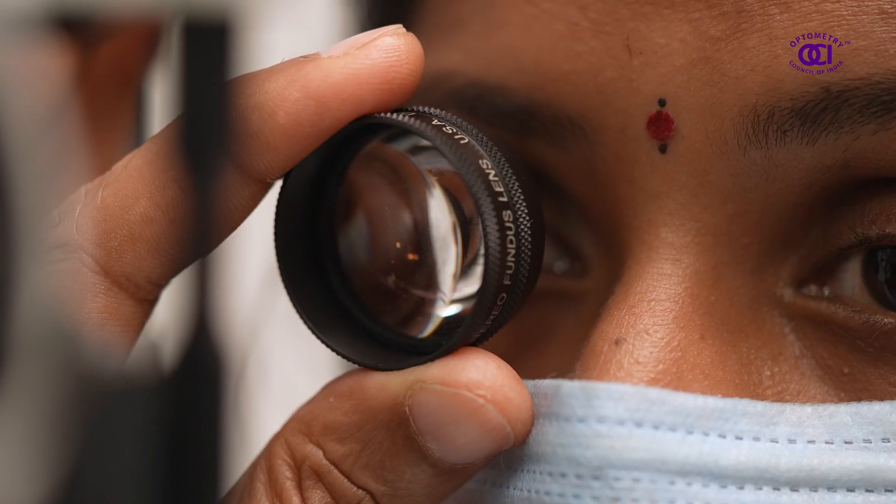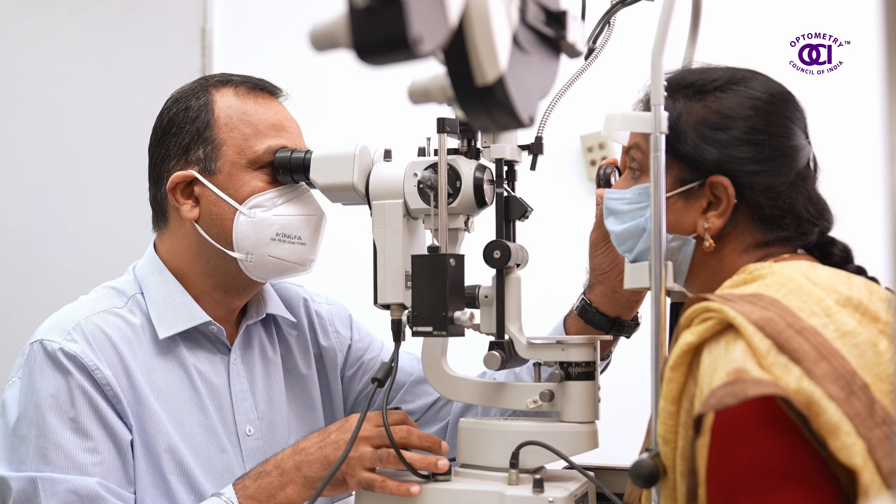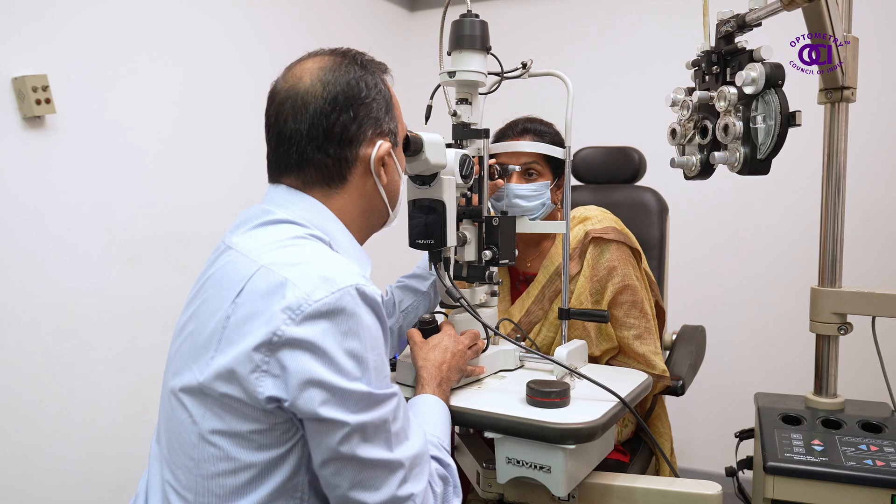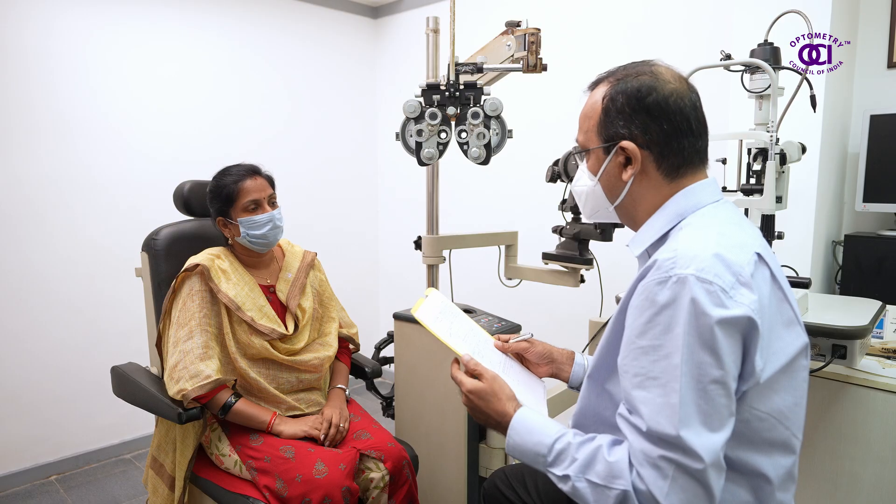And finally, the retina, which is the back part of the eye, is assessed using equipment available at the optometrist's disposal. This completes a comprehensive eye examination procedure.